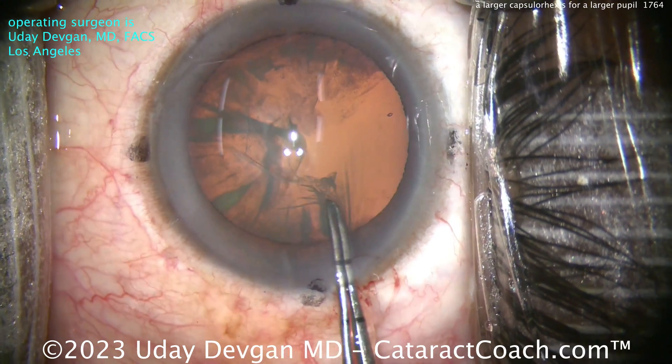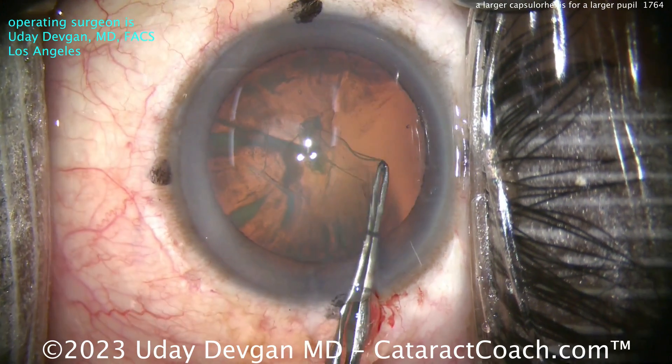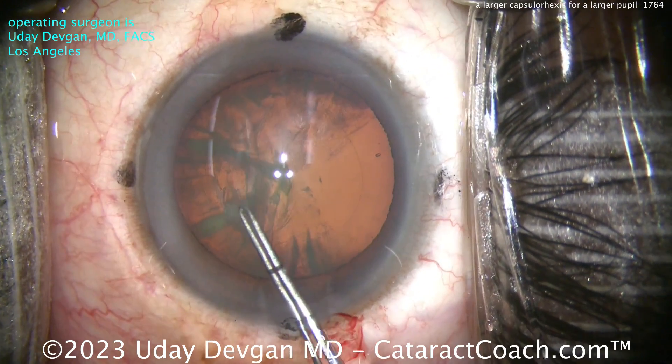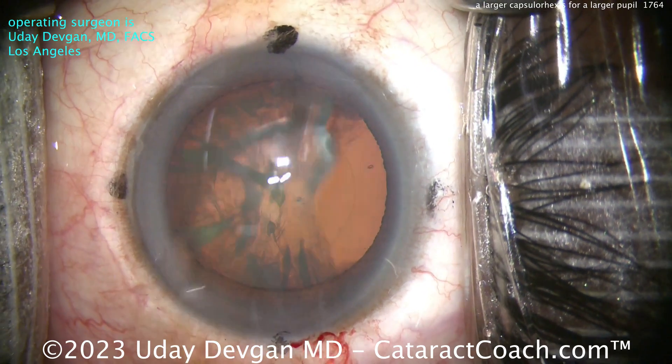My forceps are marked at two and a half and five millimeters on the tip. But in this case, I want to get right up to the edge of where the optic is. So I want a rhexis that's just a little bit less than that six millimeter optic — maybe a 5.7 or 5.8 millimeter rhexis. It's hard to say exactly, but that looks pretty good.